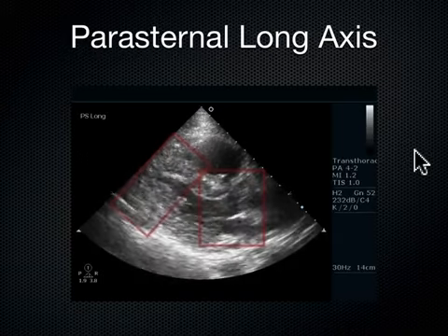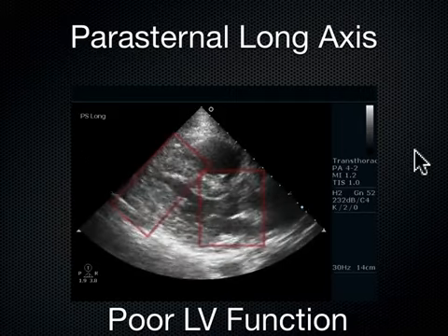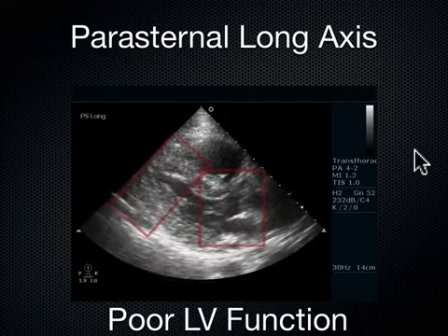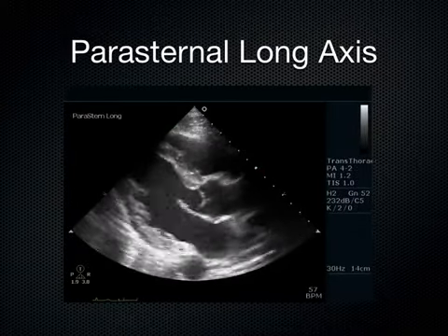So this patient had very poor LV function, but when we were able to give this patient some thrombolytics, that cleared up that blood clot, blood got back to the lungs, and this patient actually had a pretty decent outcome. What about this one here? Fluids or inotropic therapy?